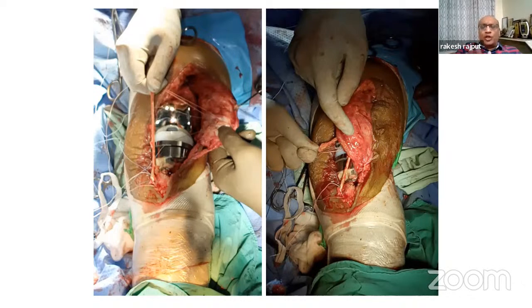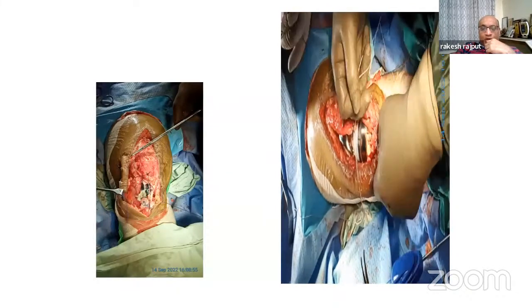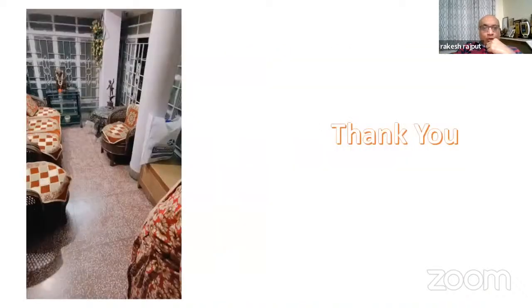So with a lot of trepidation, I used suture anchors. And I think you can just see the final preparations being done here, and that's the whole tightening of these anchors. I'll just show you the post-op exercise. If you see the lateral view, we've actually used anchors to tie up and bring this whole thing to the medial aspect. Otherwise, there was just no way to reattach this tendon there. So we were also very apprehensive whether we'd get any semblance of normality for her.